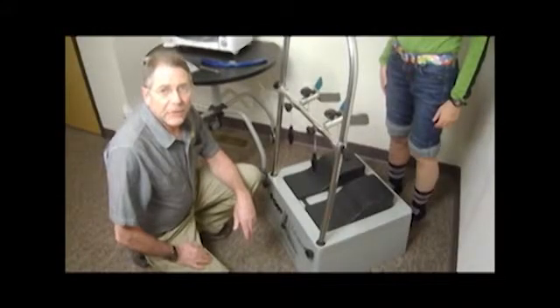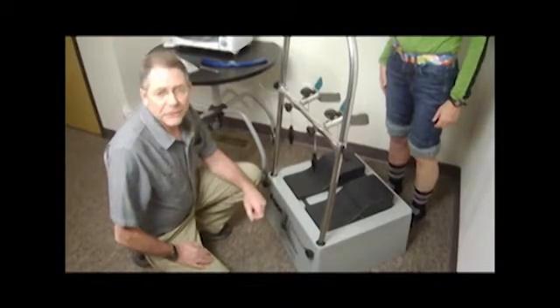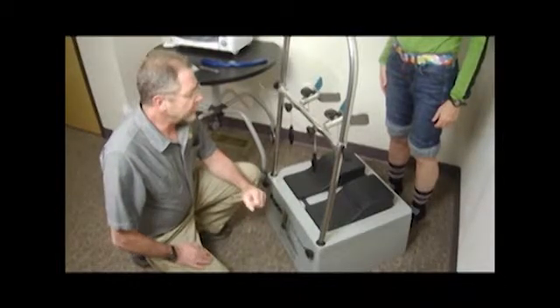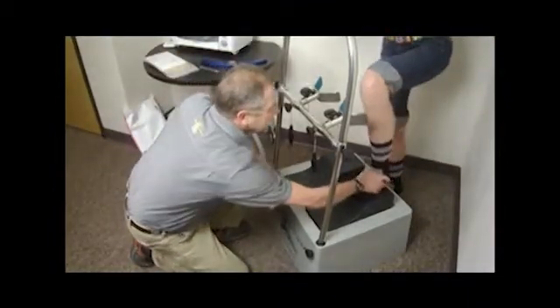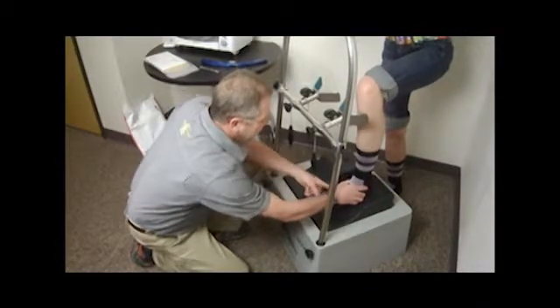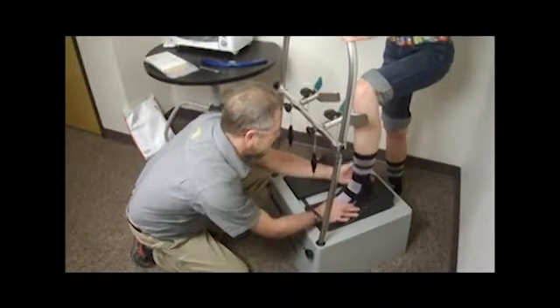Now that we've done the evaluation, we're going to take the foot impression. I put my patient back in her socks because there's a little bit of heat involved. It's not uncomfortable, but it's just a little creature comfort. First thing I'm going to do is have the patient face me and have you hand me your left foot. Grab the foot in midair so that you can take control. You're going to place the foot, the big toe joint, first MPJ, at the arrow on the pillow. Make sure that the heel is centered on the pillow.